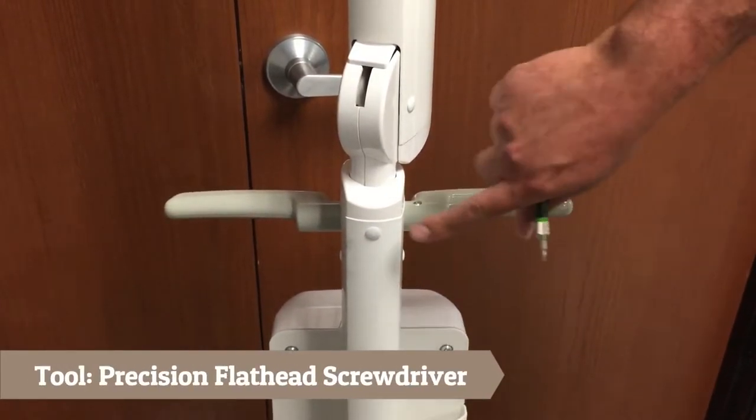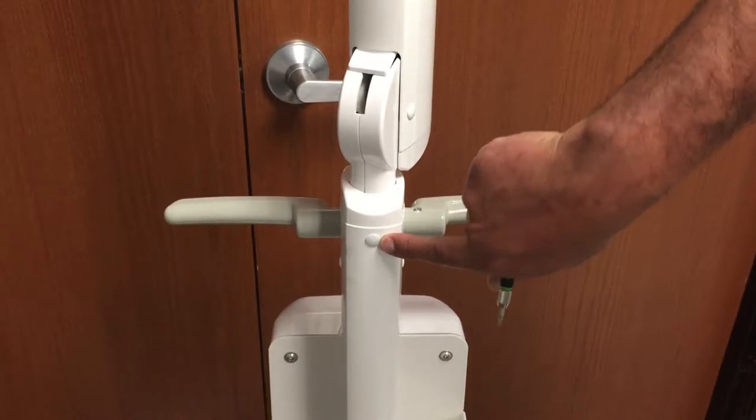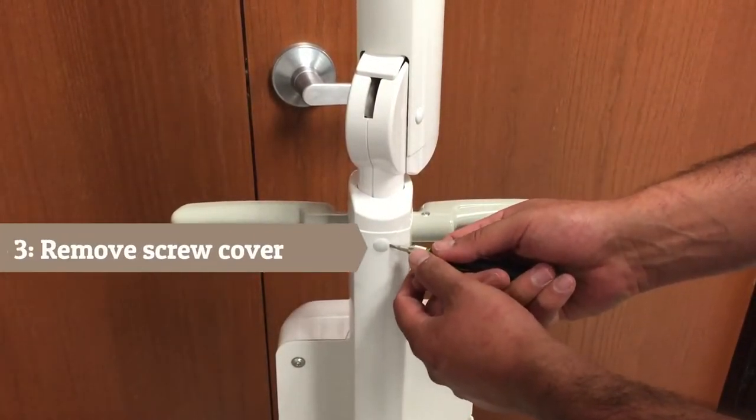Step 3: Remove the screw cover on the top center of the upright using the precision flat head screwdriver.